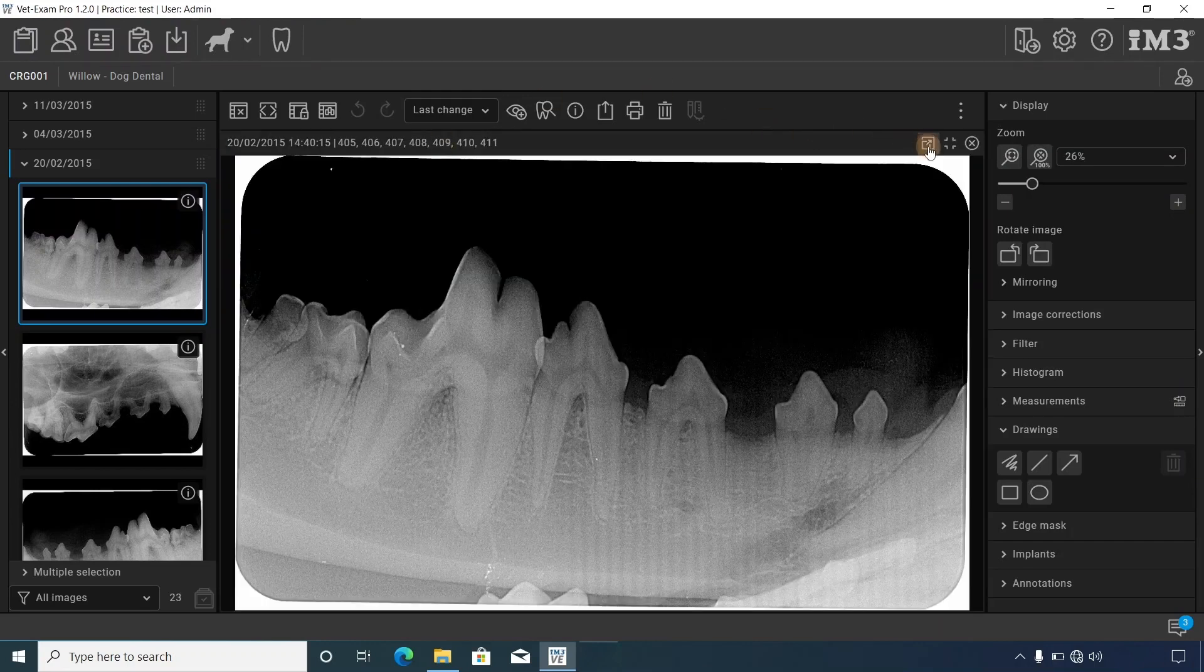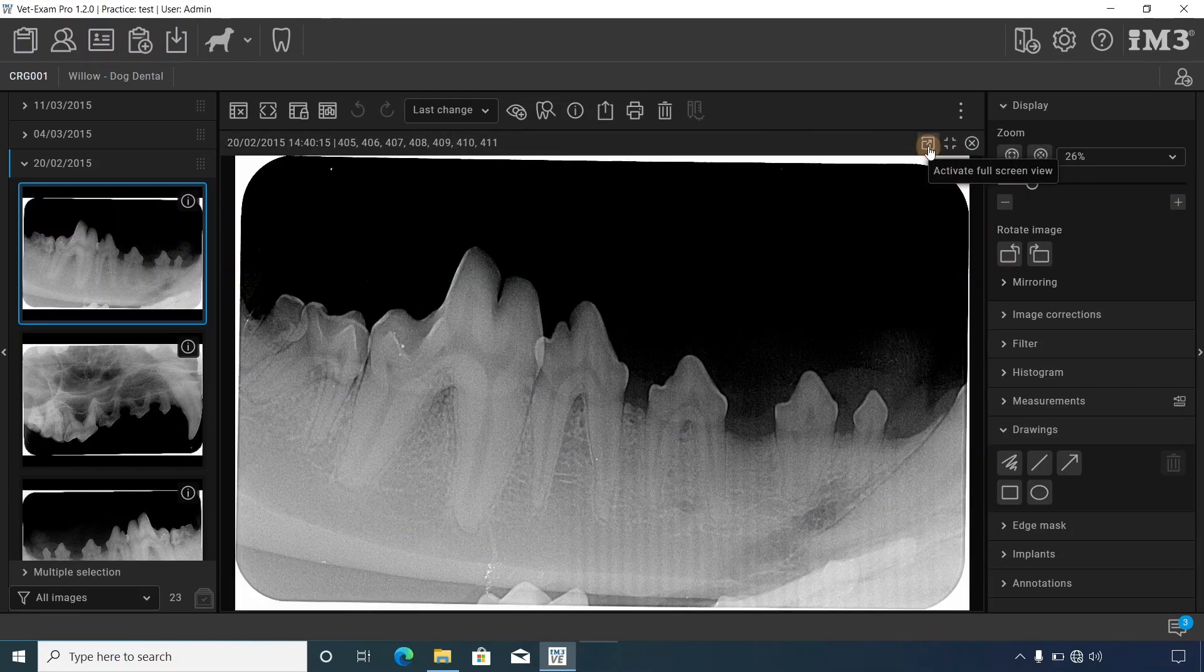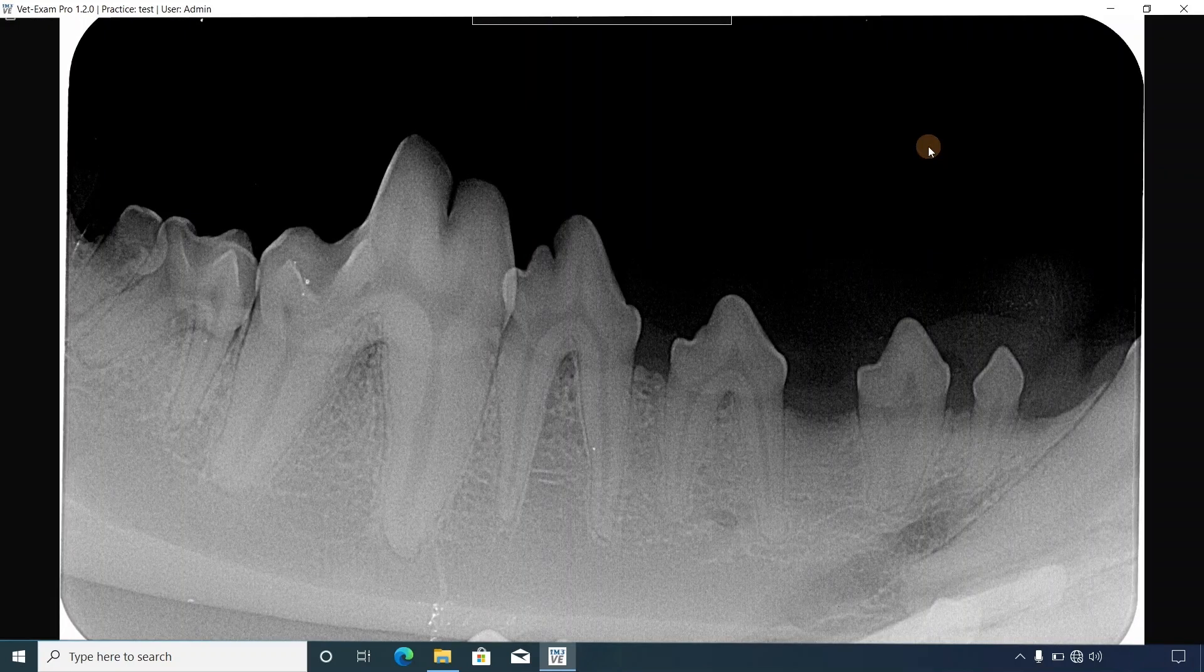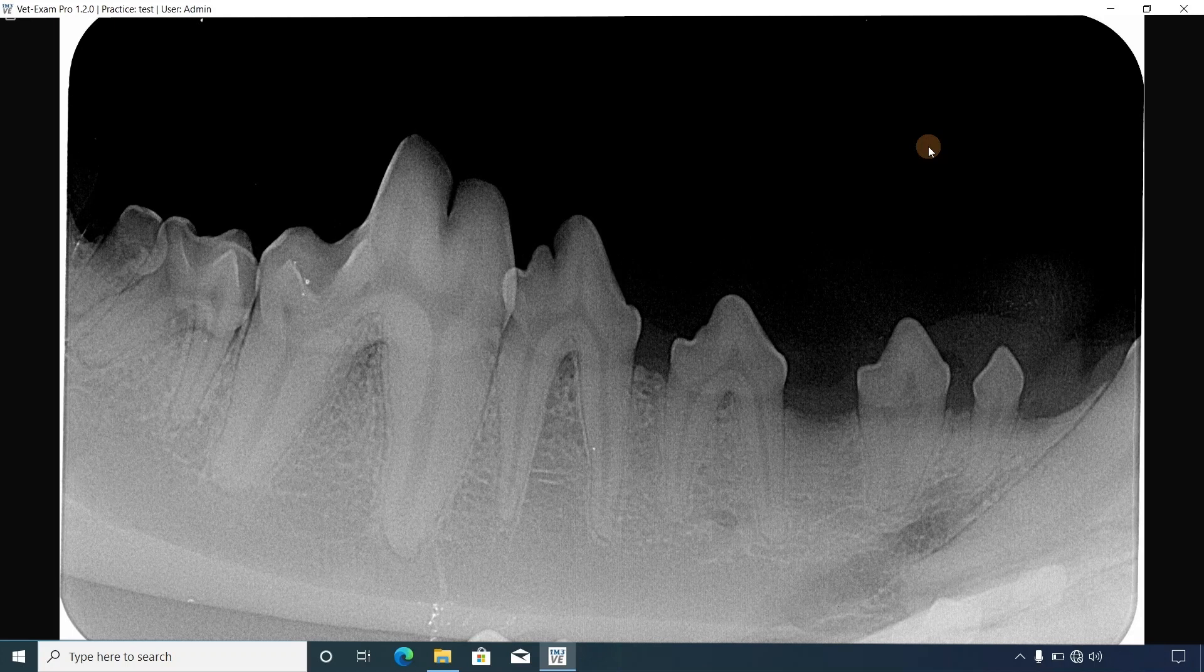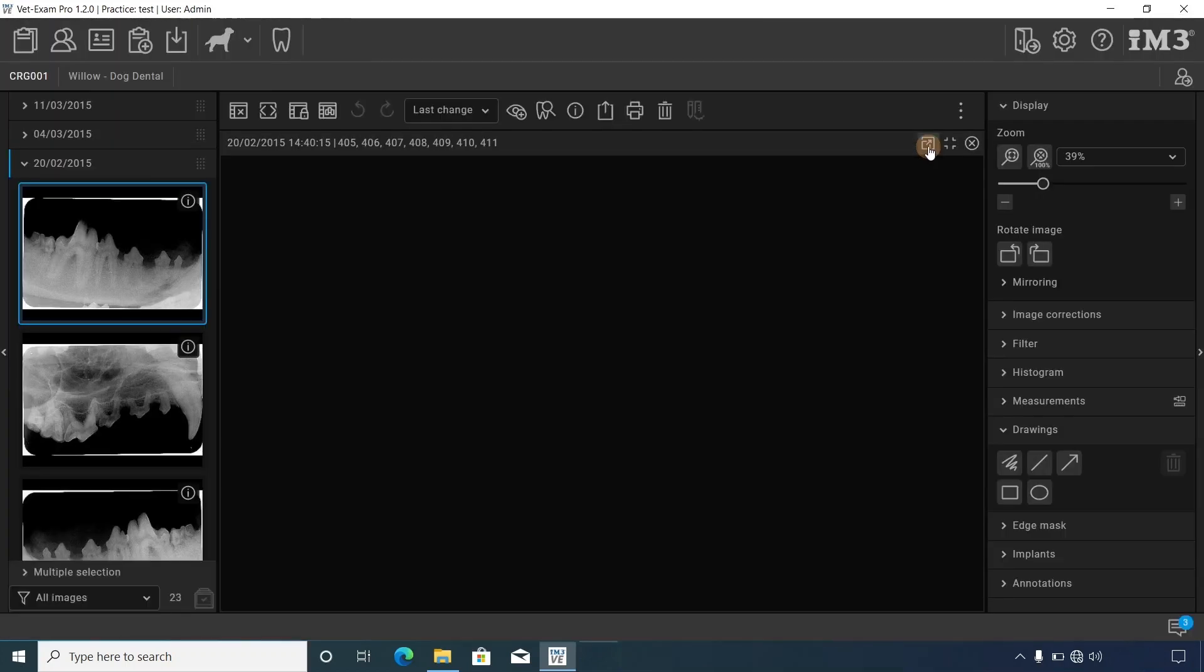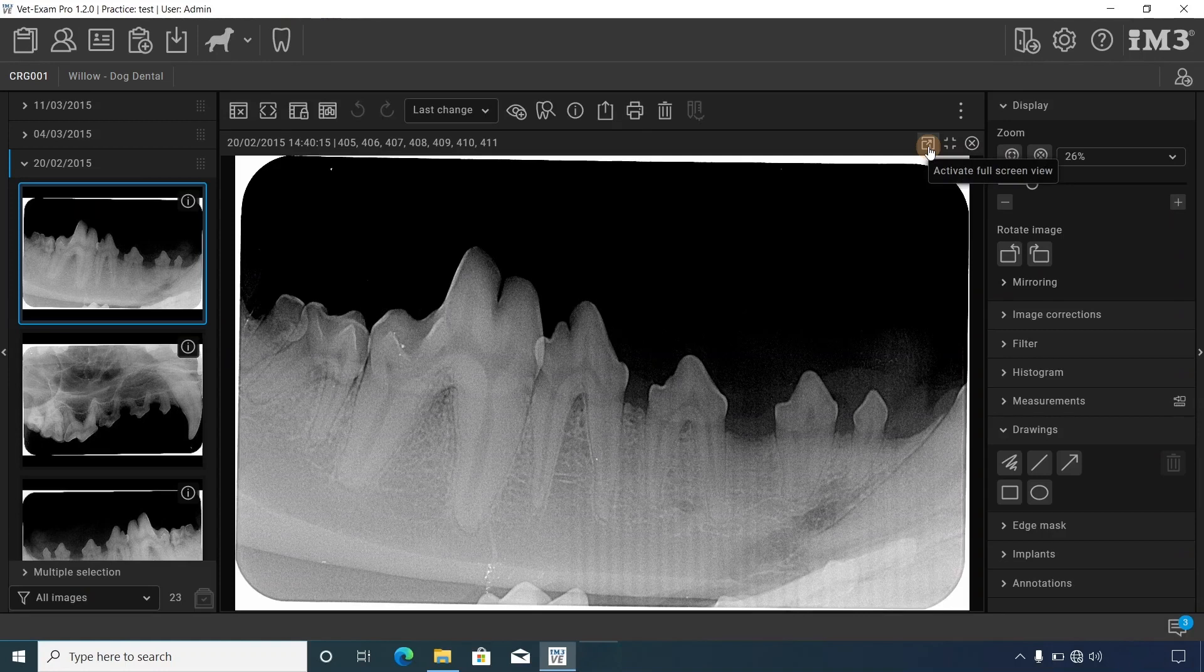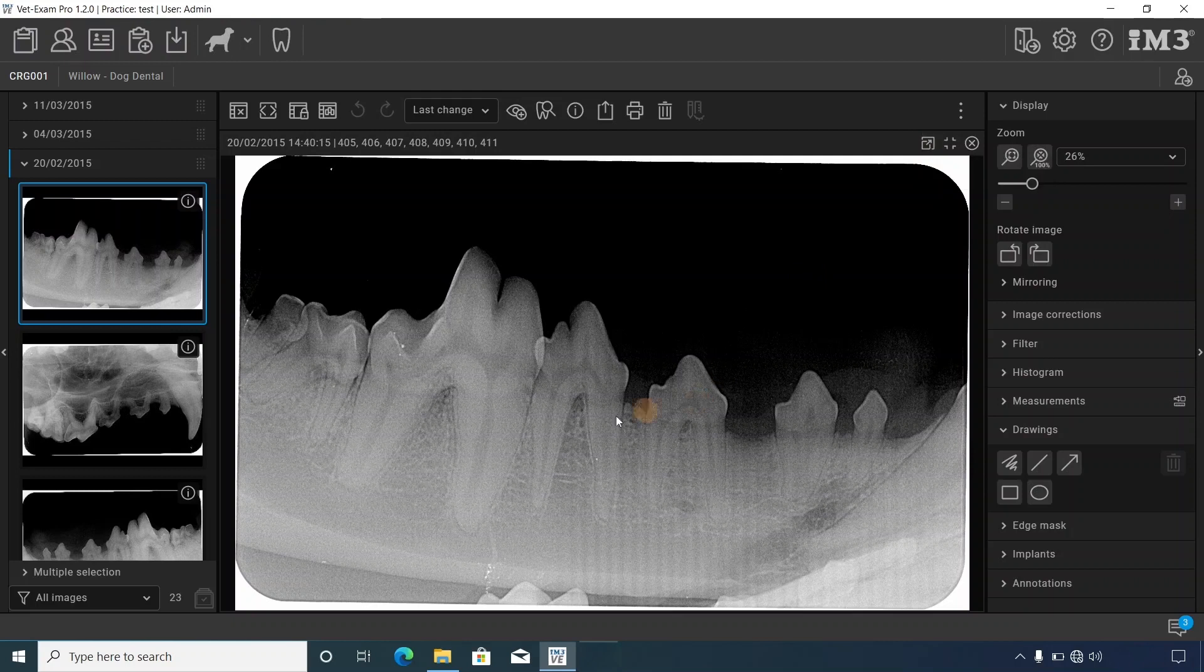To activate full screen view and fill your monitor screen, click that icon. To exit full screen, press the escape button on your keyboard. Click and hold the left mouse button to navigate the image.